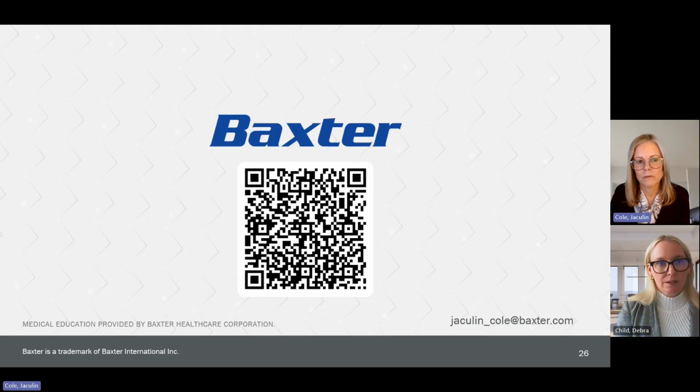I think that also supports the need for standardizing your label placement so that the nurse can very easily look at that syringe, see those demarcations and any other identifiable parts of the syringe, and confirm the syringe that's being identified by the pump. Yes, want to make sure those labels are not in between the pump and one of those sensors, which would cause an error in the reading, for sure.